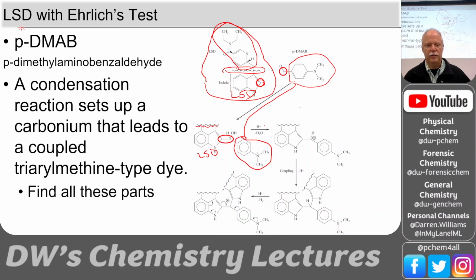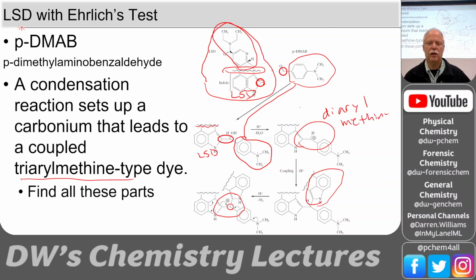And so then we add some acid, we lose a water, and then we form this diaryl methine. We can react it again and put another LSD molecule on there, and then pull out hydrogen upon adding acid. And so then we end up with this triaryl methine. You can see the methine part is right here, and then the three aromatic systems surround it. Okay. At this point here, we probably get a color change too, because this is a diaryl. And so this is how PDMAB detects LSD. Okay.